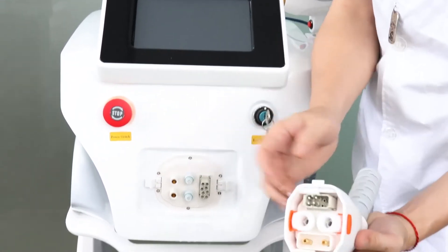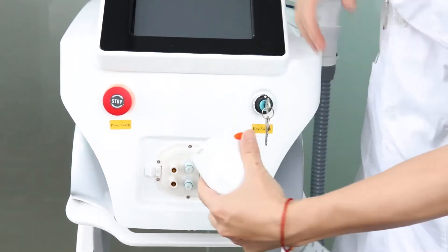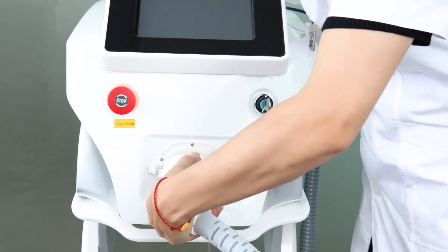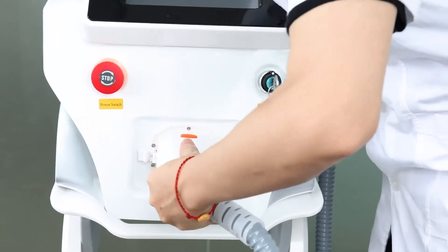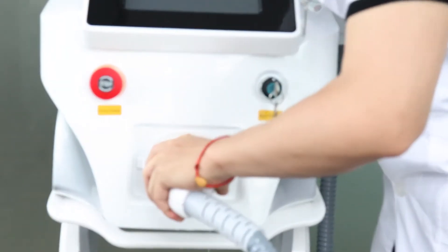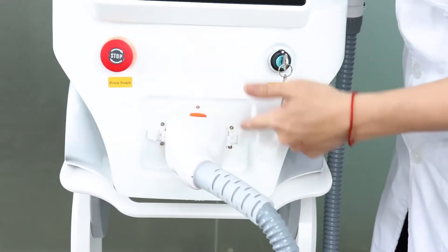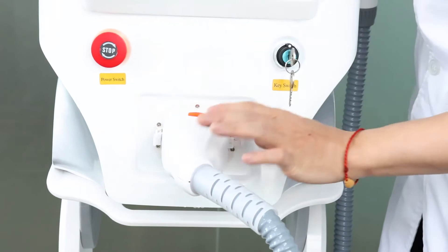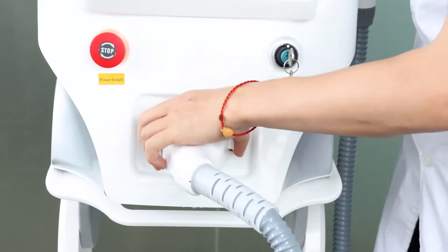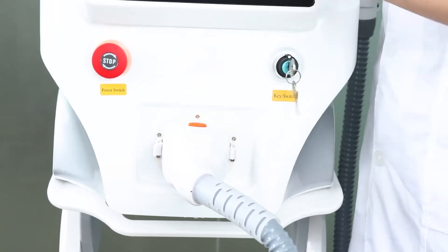So now we connect it. You will see there are two sides — you can press this, it's easy to connect. Press it and push it, and you will hear the sound. On two sides, they have a convex position — just fix it. Now the handle is fixed. This is the first step.